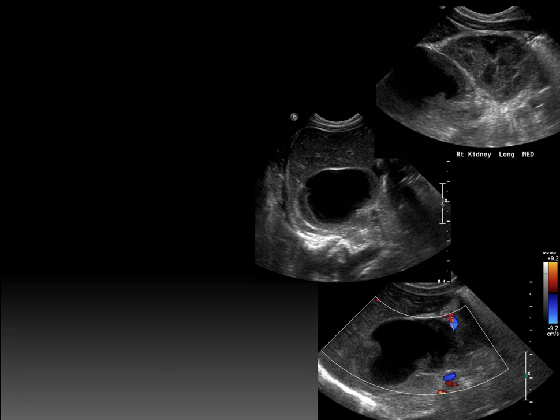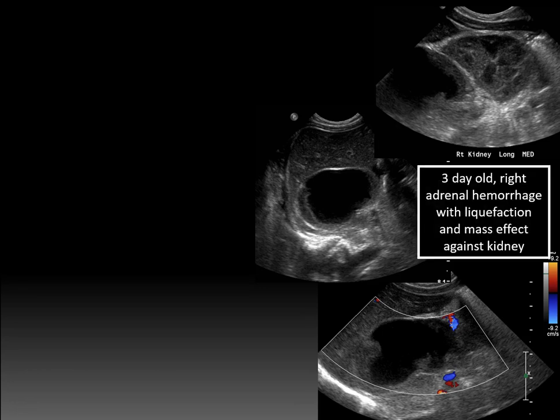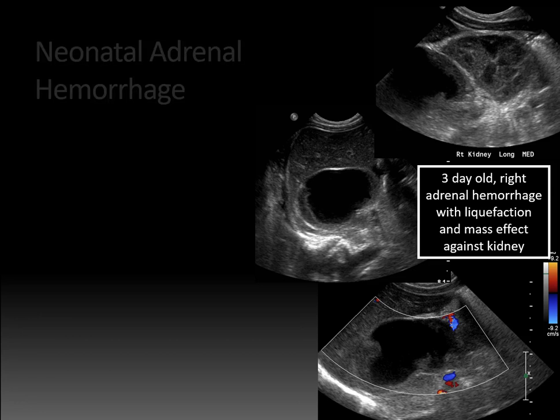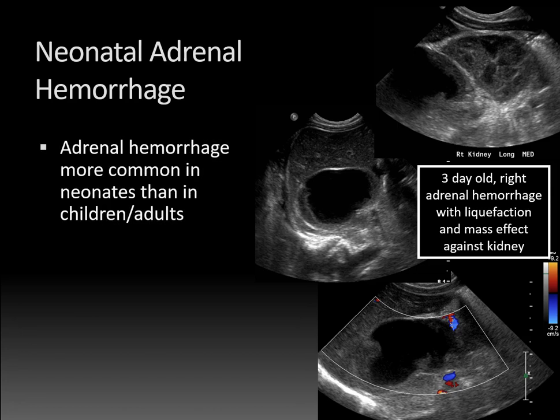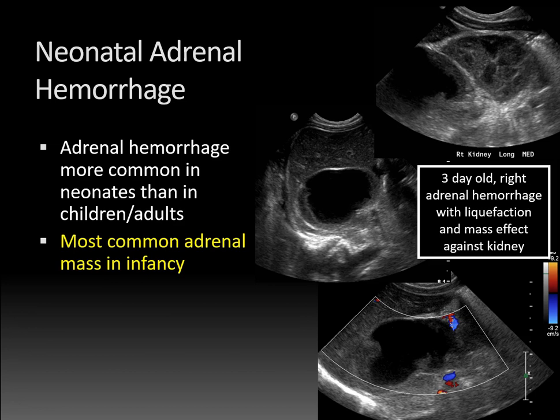A cine clip from that same patient nicely shows in real time the mixed cystic and solid components of that right adrenal hemorrhage — the anechoic black areas correspond to hemorrhage components that are liquefying. Adrenal hemorrhage is actually more common in neonates than in children and adults; it's the most common adrenal mass in infancy, so important to remember. Causes include various neonatal stresses, difficulty with birth, or hypoxia.